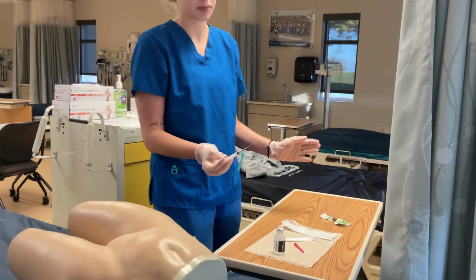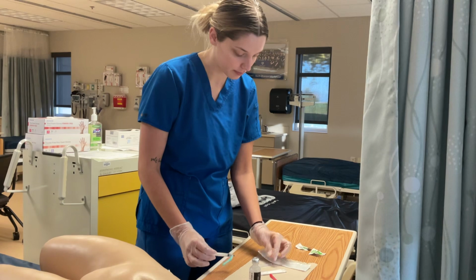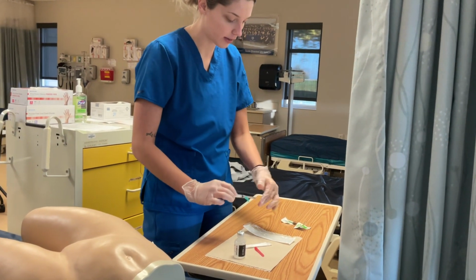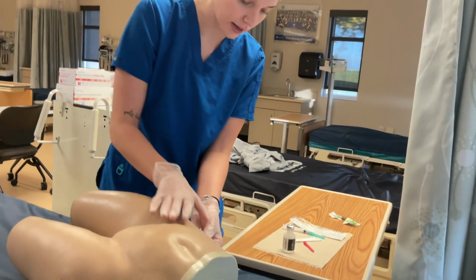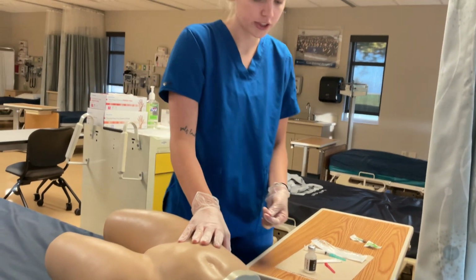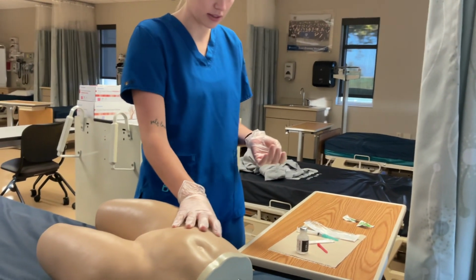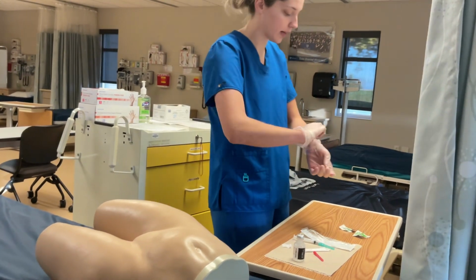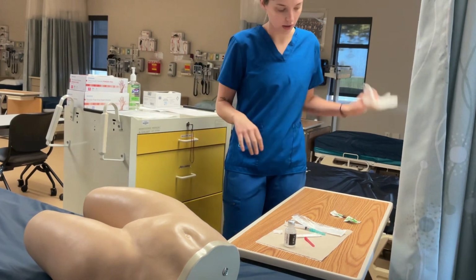For practicing purposes, I'm not going to pull the safety yet. And then I would hold a 2x2 gauze there with pressure. I would assess if a Band-Aid is needed. And then I will take my gloves off and throw that away.